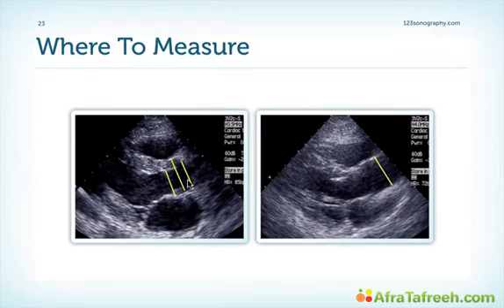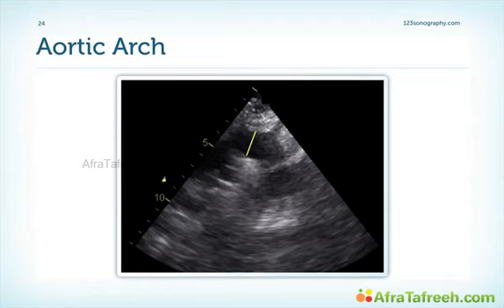And then I switch the imaging transducer position to visualize more the cranial portion of the ascending aorta, and then measure here, or where I find the aorta to have its largest width. In all patients who have an aneurysm, I also image the aortic arch to see if the aneurysm extends into the aortic arch. And the measurement I perform is shown here.